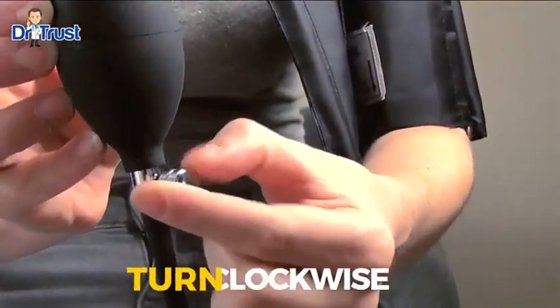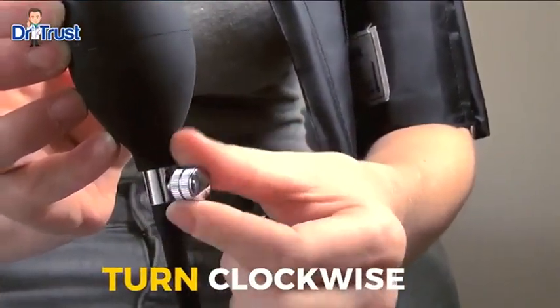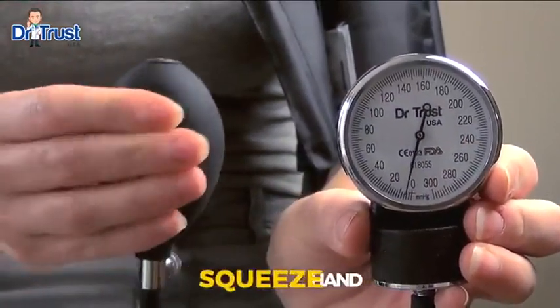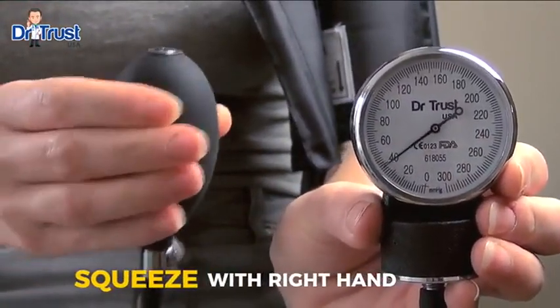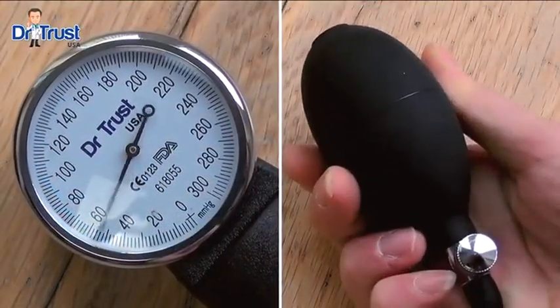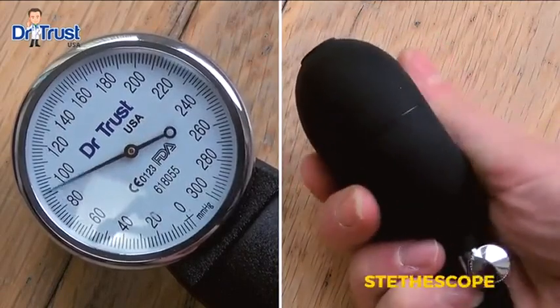Close the air valve on the hand pump by turning the screw clockwise. Hold the pressure monitor in your palm and squeeze the inflation bulb with your right hand at a steady pace to inflate the cuff. It's recommended to inflate the cuff to 200 millimeters of mercury for your first measurement and to 30 millimeters of mercury higher than your normal systolic pressure value thereafter.